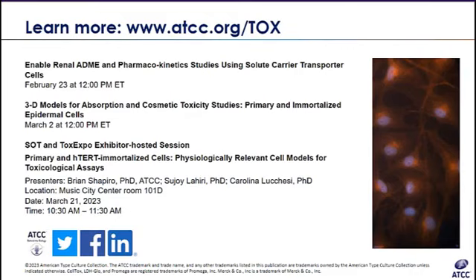Now, this is just a general question. Can hTERT cells be used on flasks without, say, a lysine coating? I kind of feel like there are two answers to this. The first answer is yes. The second answer is, well, it depends. If that specific cell type requires a lysine coating, then you would need that.